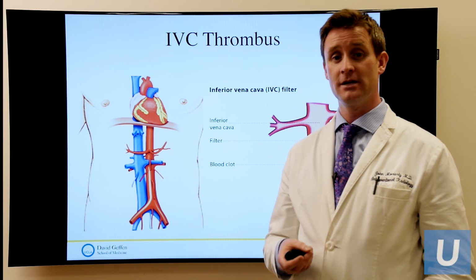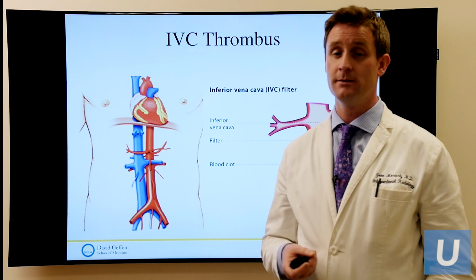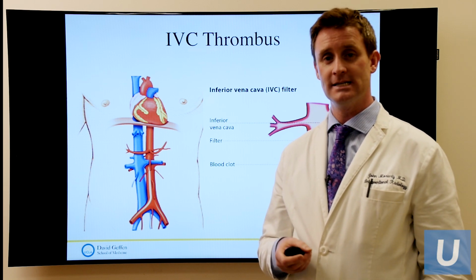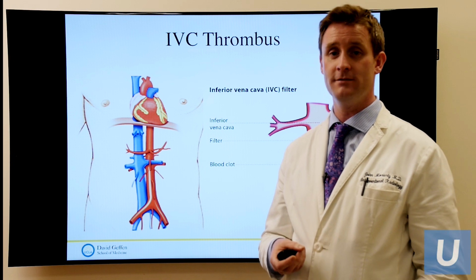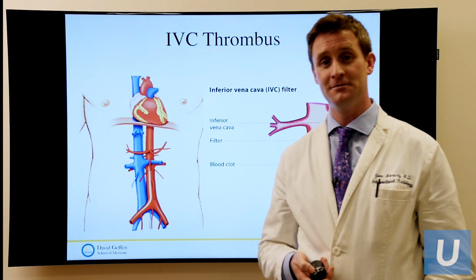Removing these filters is increasingly important with large filter clinics like ours, seeing people who've had filters for many years or filters that have become problematic. And certainly if you have a problem with an IVC filter or any questions about it, please contact us at the numbers that I gave you earlier on, and I'll give it to you again later on.